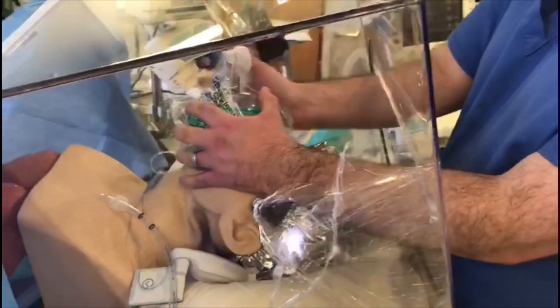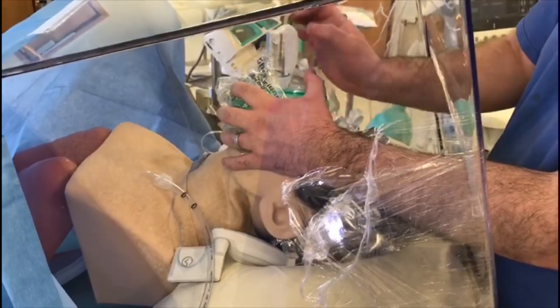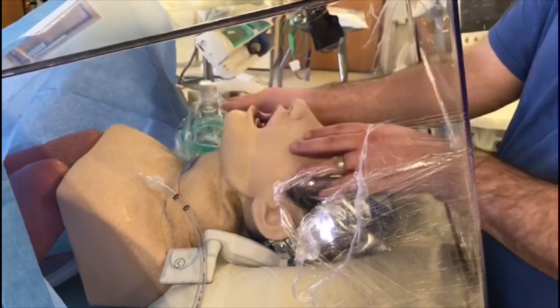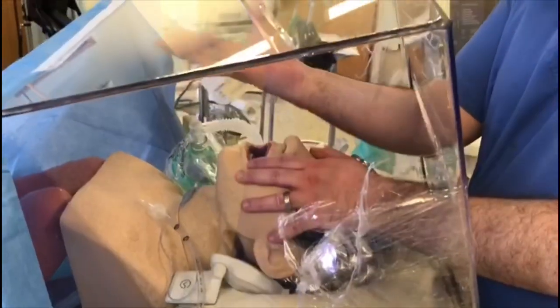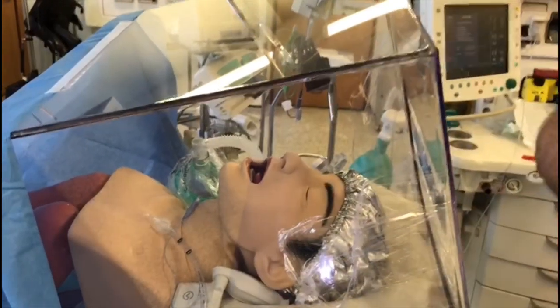We could have an entirely new circuit with a filter already on, ready to make a smoother transition. So that's the idea of the box — it will contain the spray and coughing largely to the microenvironment of the tube. Perfect. Thanks.